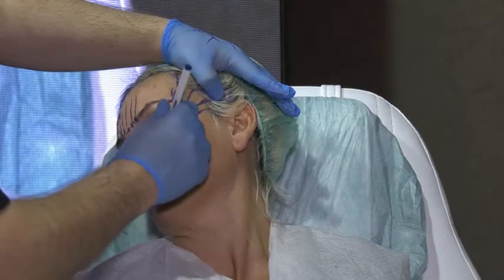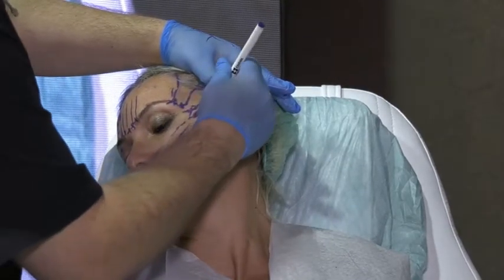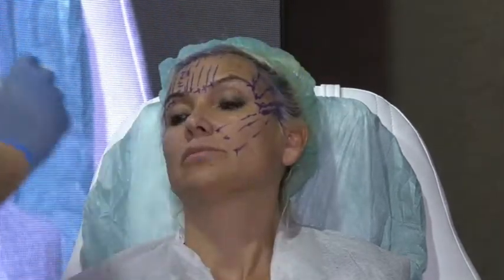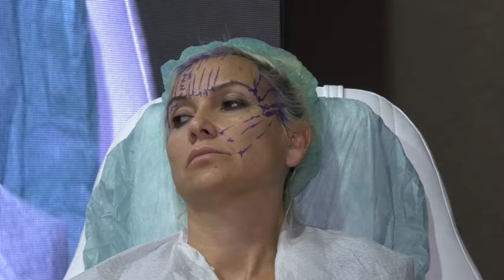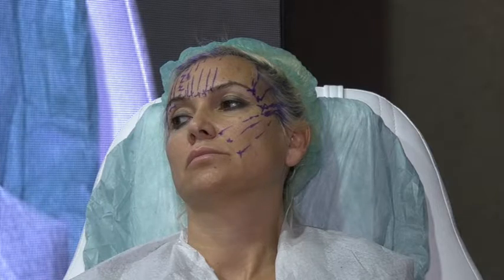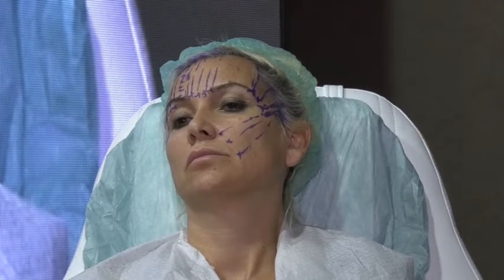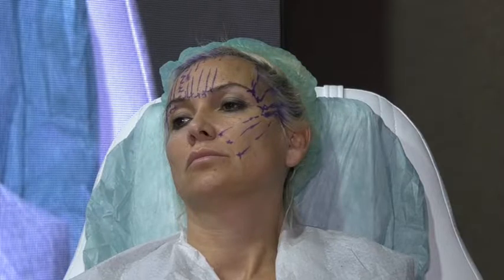Now we'll go to that. There's 1, there's 2, and 3. Okay? So this is my 3 points going to that. I finish the mid-face zone. We'll go now to zone number 3, which is what? Lower face. The lower face. Lower face itself is divided into 2 zones, which is marionette and jawline.